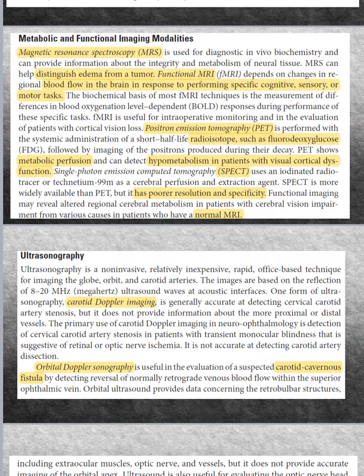The diagnosis was cluster headache. This patient may have what? And the right answer was that the functional MRI will show hyperactivity in the hypothalamus. So this one was good. The functional MRI may be done to detect hyperactivity in some areas, and in cases of cluster headache, you may see hyperactivity in the hypothalamus.